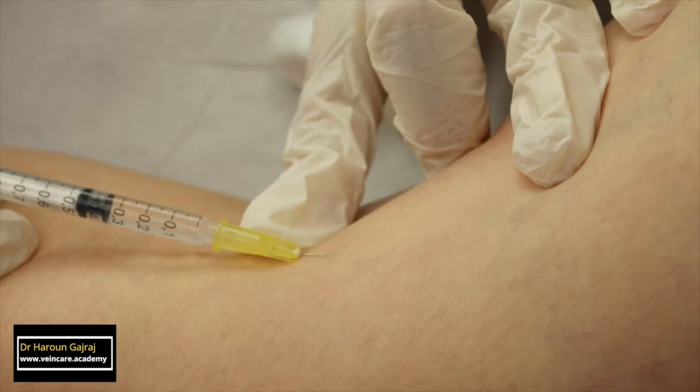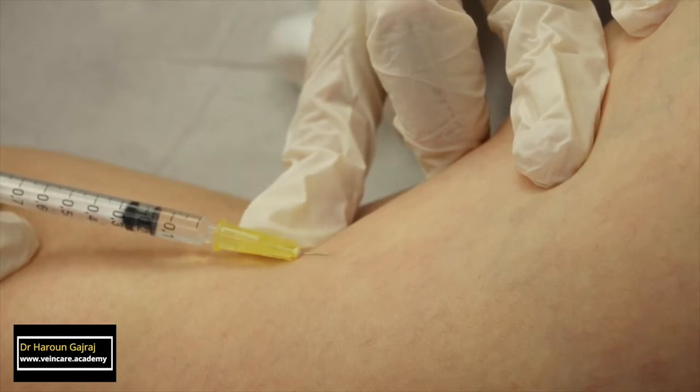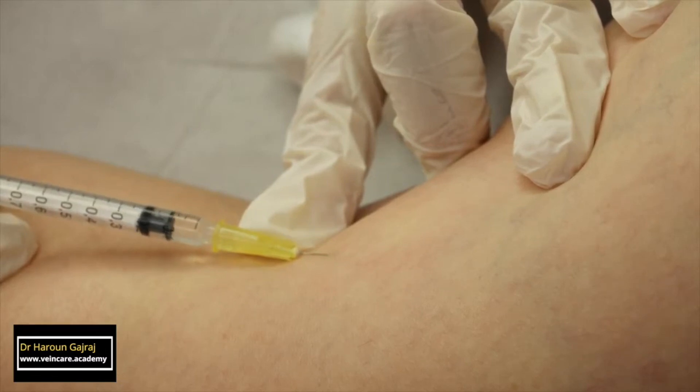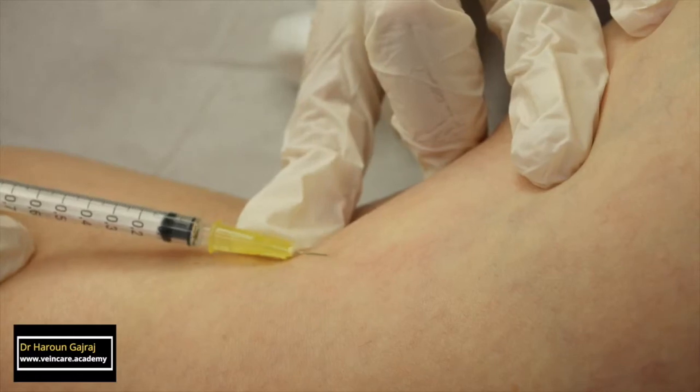Injection must be stopped if resistance is felt, if the tissue around the injection site becomes raised, or if the skin around the vein blanches. And it's a good precaution, at intervals, to ask your patient to bend his or her ankle up and down to promote the flow of blood through the deeper veins, in order to minimise the risk of gastrocnemius vein thrombosis.